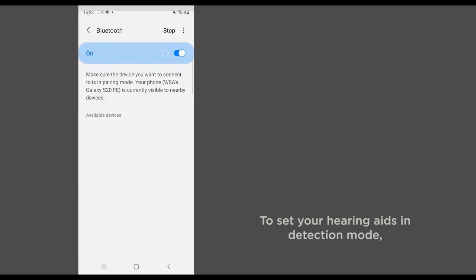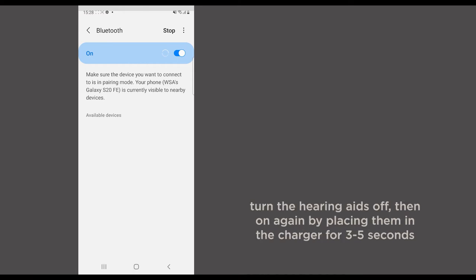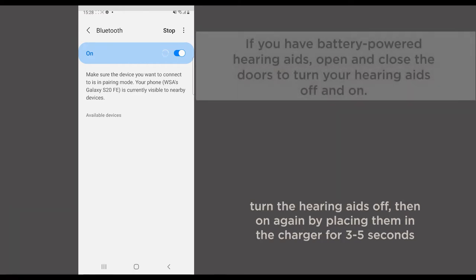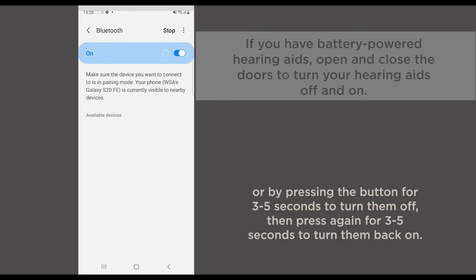To set your hearing aids in detection mode, turn the hearing aids off, then on again by placing them in the charger for 3-5 seconds or by pressing the button for 3-5 seconds to turn them off and then press again for 3-5 seconds to turn them back on again.